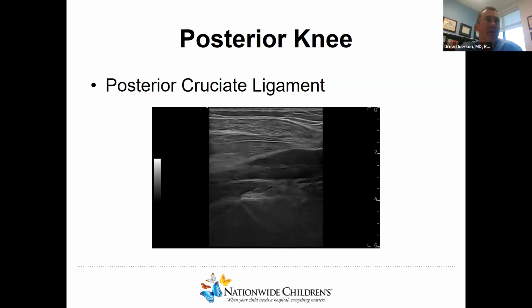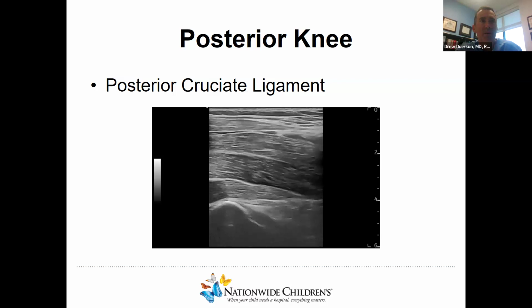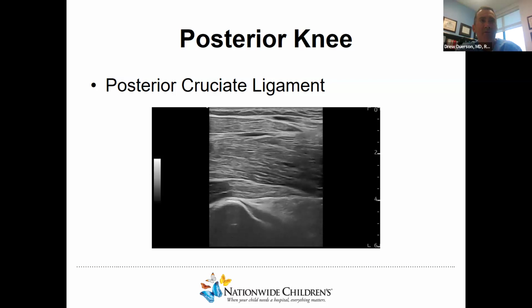And the trick here is if you find the tibia, it's going to usually be a little bit flat and kind of squared off, and then you slide to the midline, and you'll see a change in shape of your bone, and then you can identify the facet where the PCL attaches. Just like all our tendons, keeping the bony landmarks nice and bright will help you be able to see that PCL attachment. And if you're seeing any thickening there, that might increase your suspicion for this type of internal derangement and maybe a potential answer for why the patient has a knee effusion.